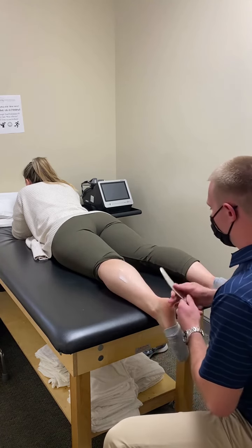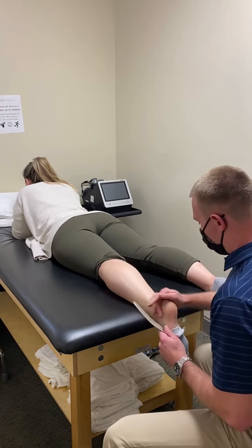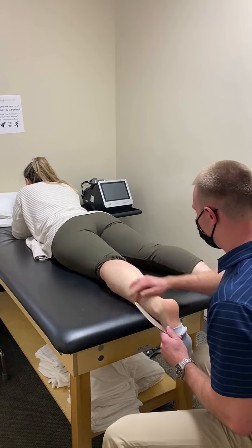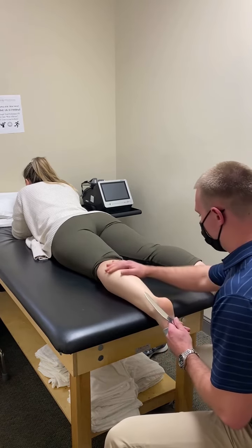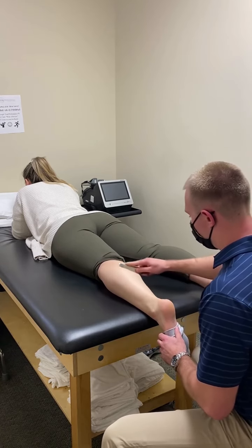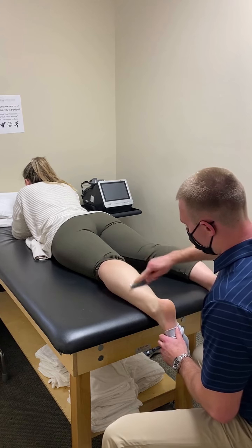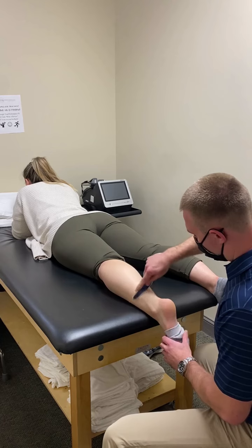What I'm going to be doing here is motioning up the tissues to allow the instrument to move freely and without as much friction. I'm first just going to scan the tissues here, looking for any abnormalities and tissue feel.